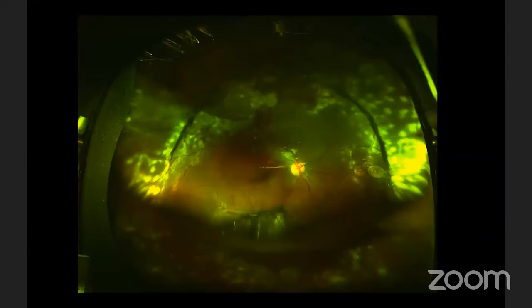This is a case of a foreign body that was not able to be removed. You can see here a glass. This is tempered glass from a car accident. The surgeon couldn't remove the glass. It was very slippery, and it was prone to break every time he touched it with the serrated forceps.